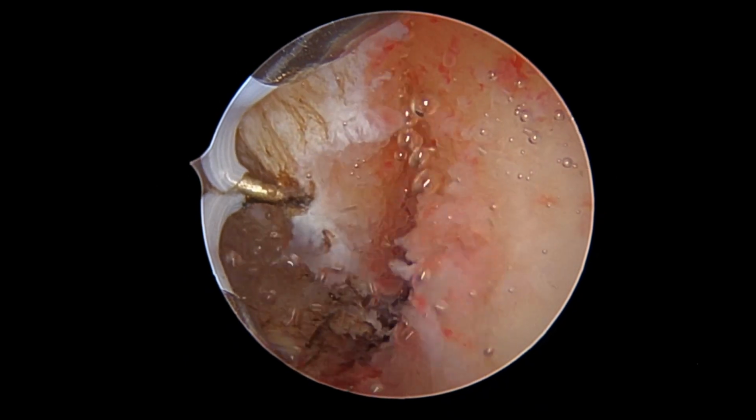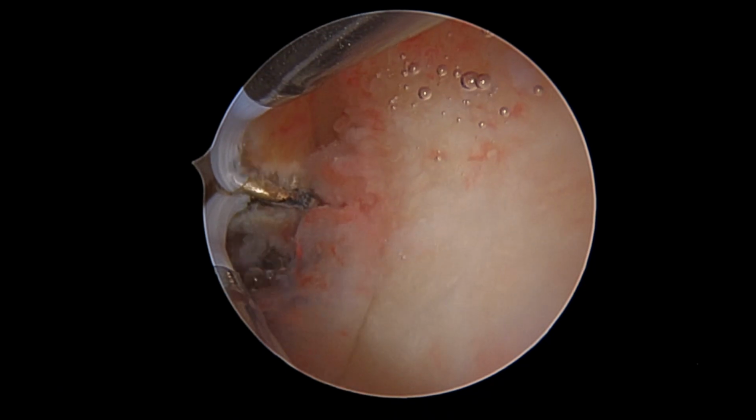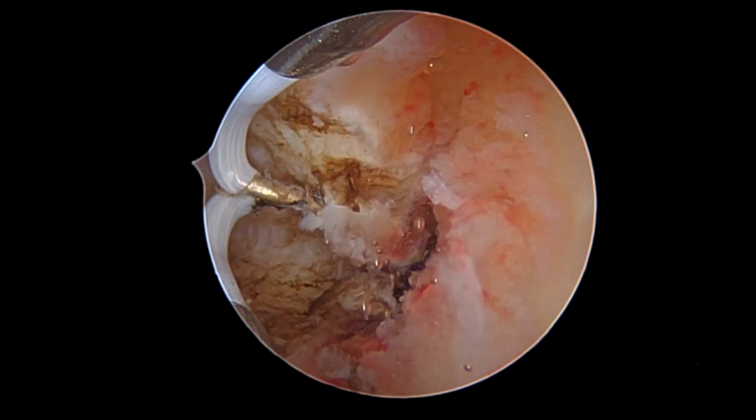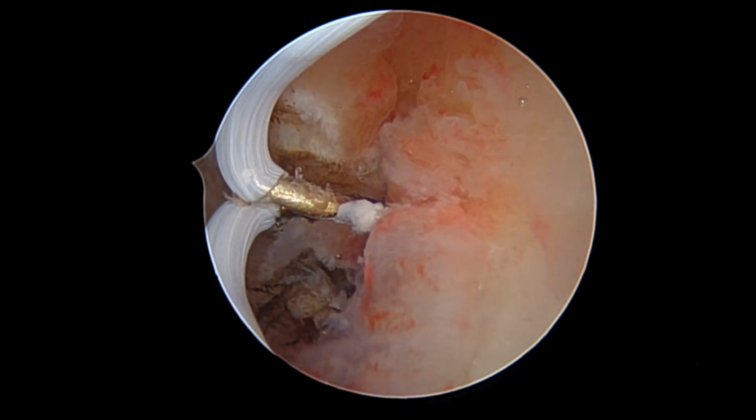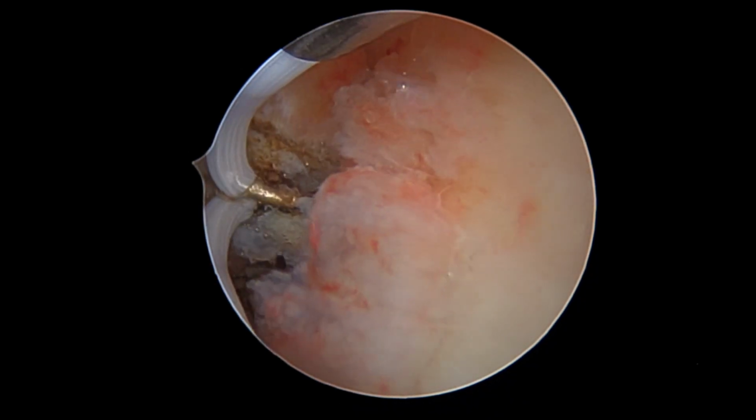Throughout the procedure, the septal tissue is divided with the cut diathermy function, and hemostasis is ensured with the coagulation diathermy function. The settings used in this procedure were 60 coagulation and 40 cut.